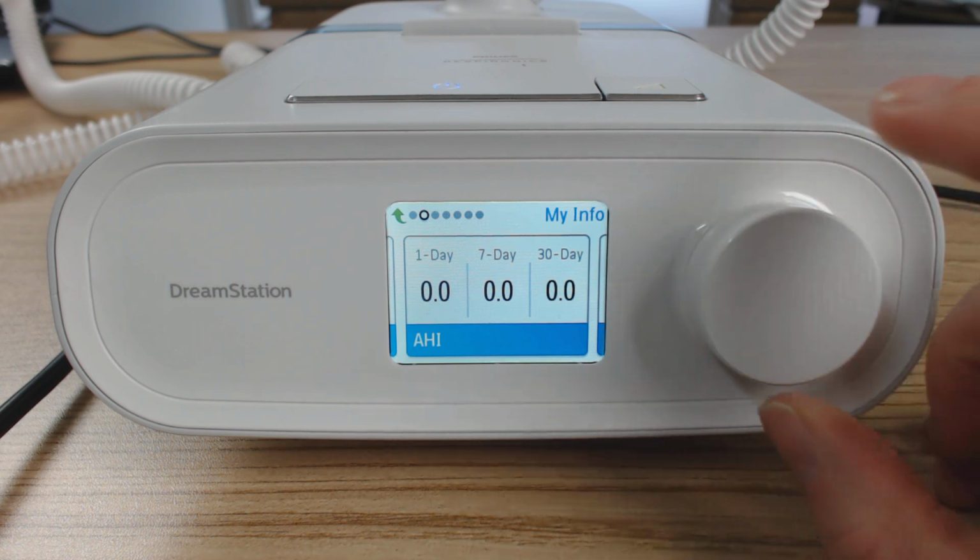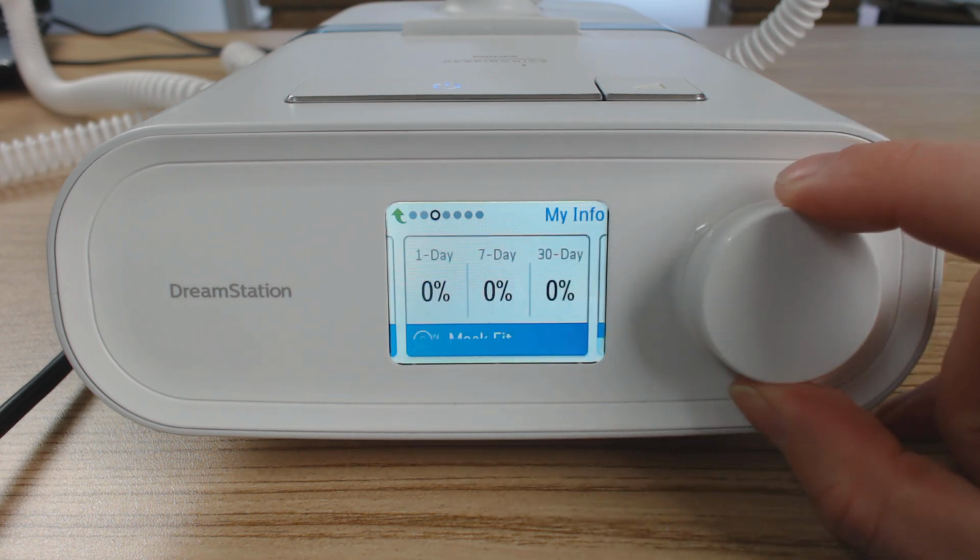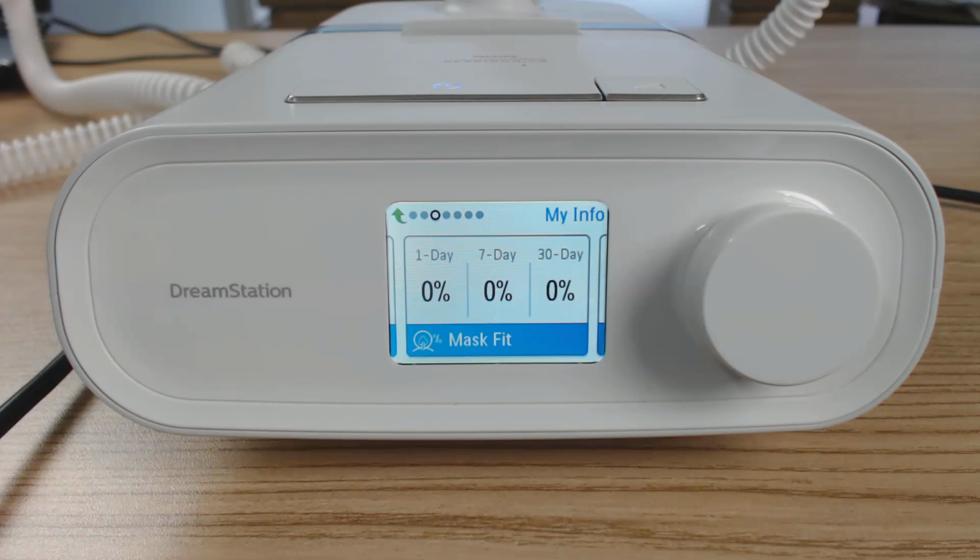We rotate one more clockwise, so just grab the dial and rotate clockwise. We have mask fit. Now the mask fit displays a value of 100% minus large leak. Large leak is the percentage of time that the mask leak was so high that it was no longer possible for the device to identify respiratory events with accuracy. So basically, your therapy starts off at 100%.